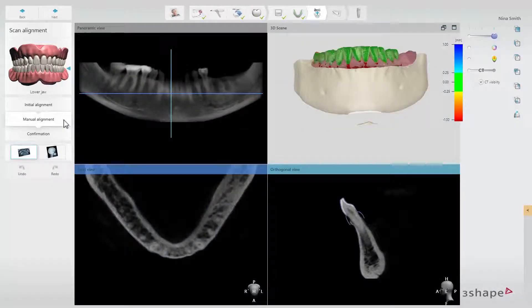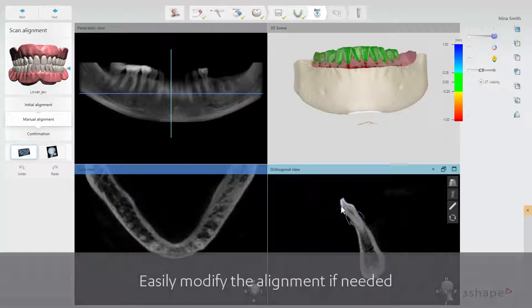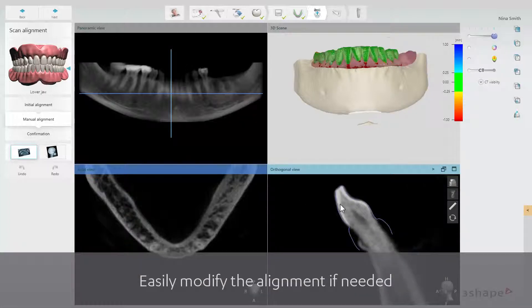If you modify the alignment manually, the difference map will show the changes in real time.